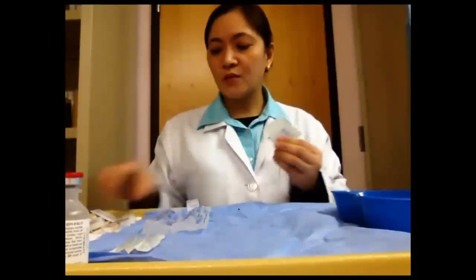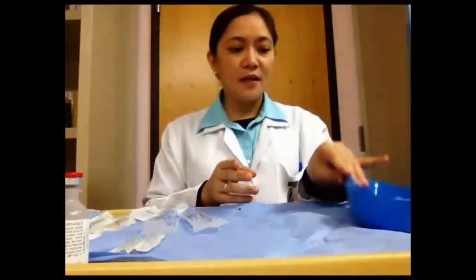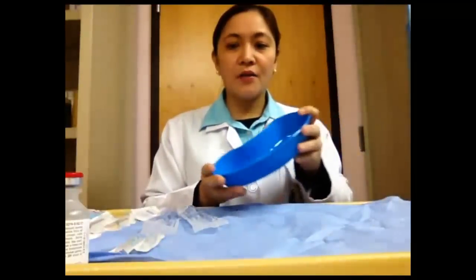Also, we need alcohol swabs for disinfectant, a Band-Aid to be applied to your patient's site of injection after the injection, and a clean kidney dish as a container of your medications while going to the patient's room. Of course, injectable medication should be prepared in the medication room, not at the patient's bedside.